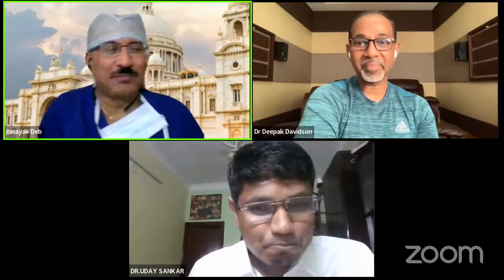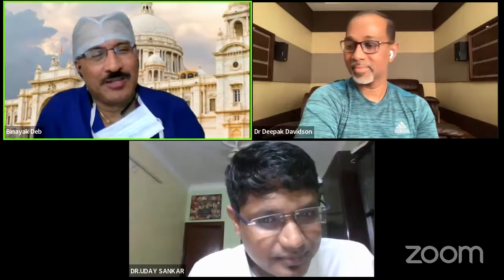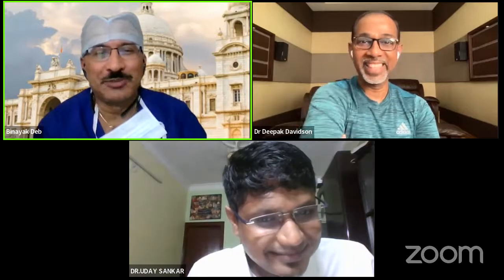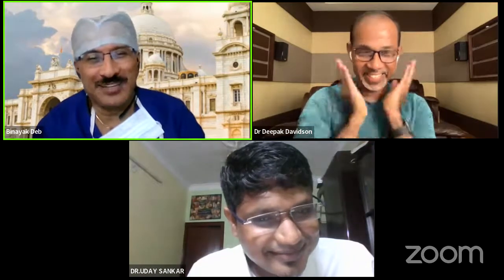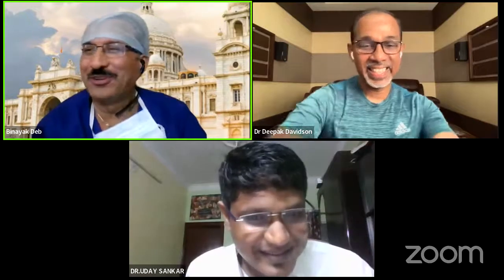Yeah, I think you're absolutely right. Pulling a wire, particularly CTO wires, given the number of coils you mentioned, the length could be from Kashmir to Kanyakumari. You can be very sure about the length of the wire. A 190 centimeter wire can easily become 800 kilometers, for all you know. So, Dr. Ghosh, your comments about using a snare against this?